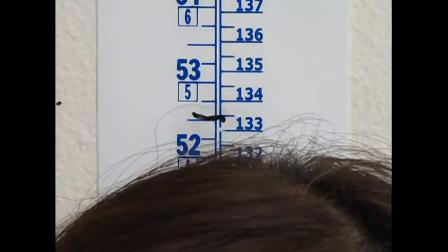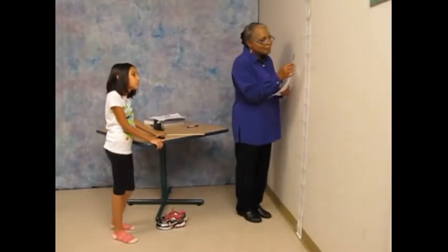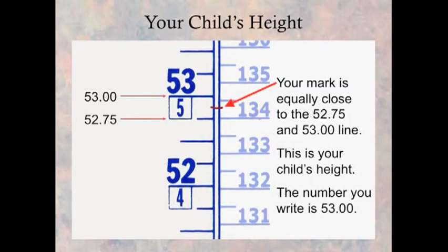Now, ask your child to step away from the chart. To read your child's height, find the mark you just made on the chart. Choose the line closest to your mark. This is your child's height. For example, if your mark was closest to the first line after 52 inches, then you would write 52.25 on the form. If your mark is centered between 2 lines, always use the line above for your number.